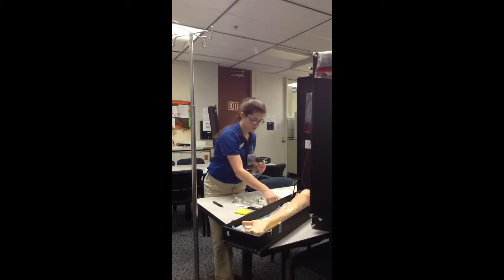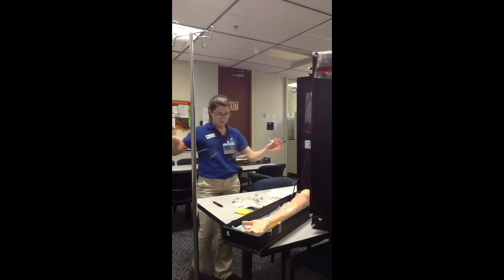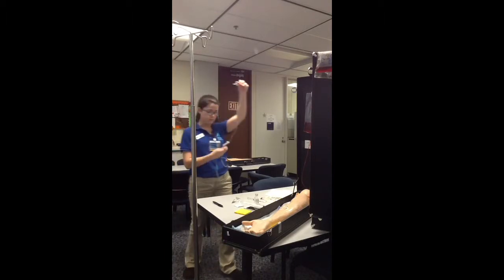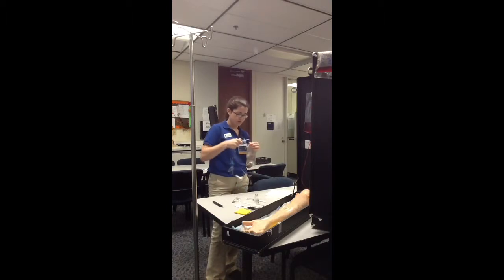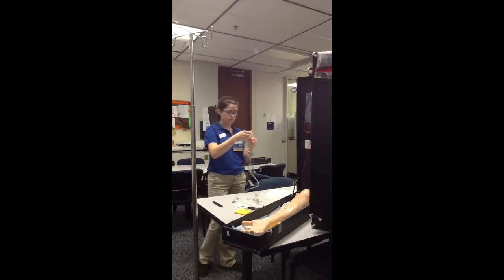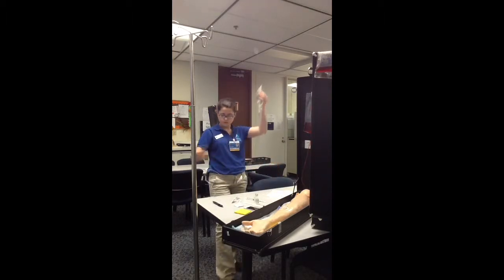First I'm going to attach a needleless device. Make sure my tube is clamped. I'm going to spike my medication bag. And now I'm going to prime my medication bag, my tubing.